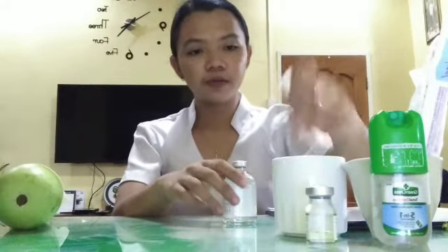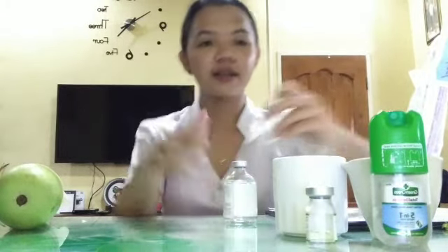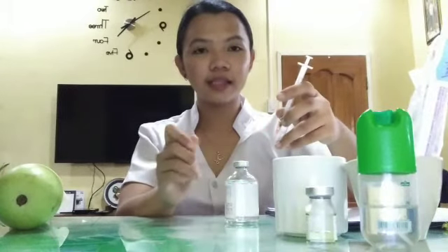So we will clean the sterile area with the alcohol, and we will discard it and let it dry.